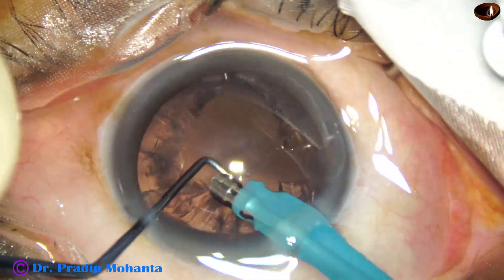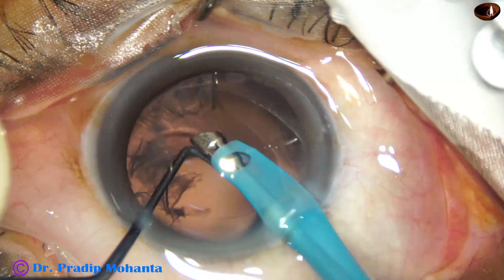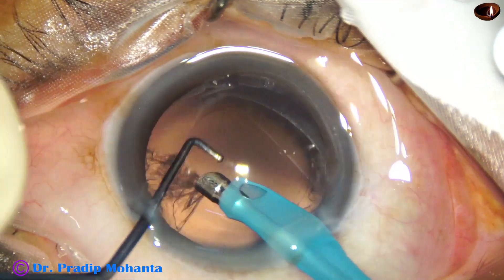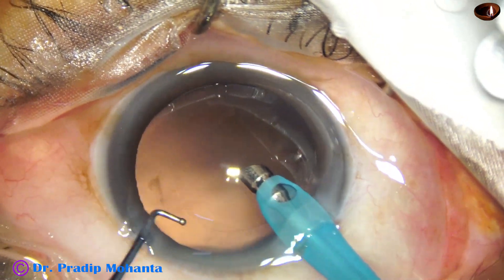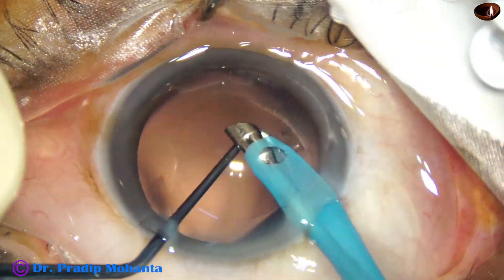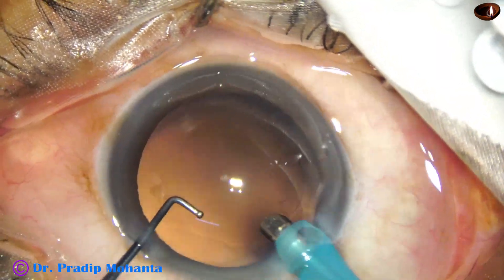Now I am using the handpiece itself for removing most of the cortex. I have learned this technique from my friend Dr. Nato Rosatelli. It can be done and it has a learning curve, but once you learn it, you will enjoy it.